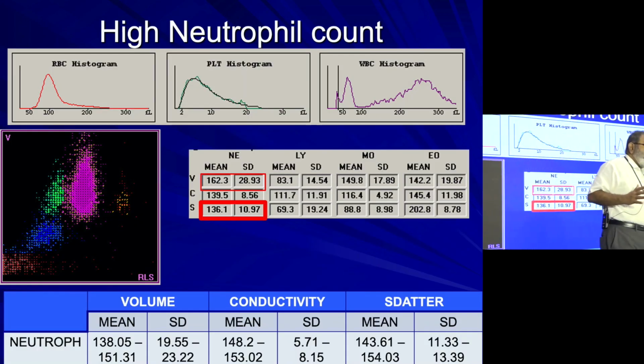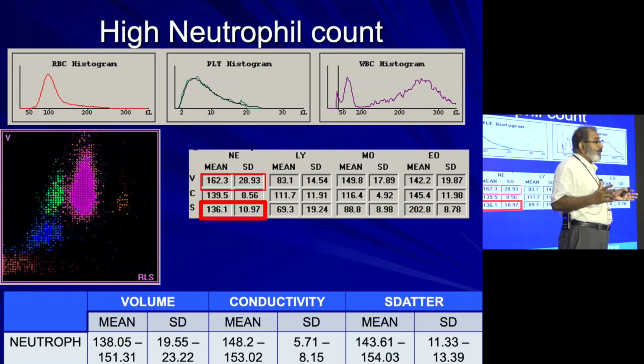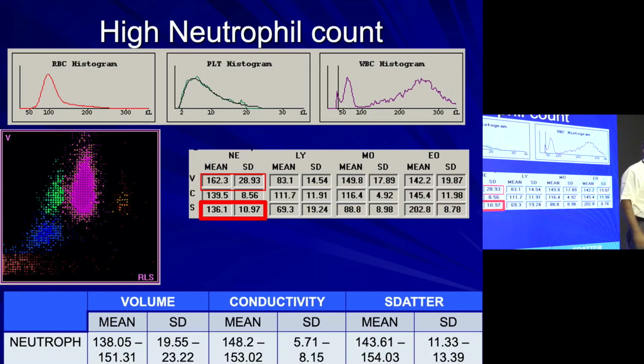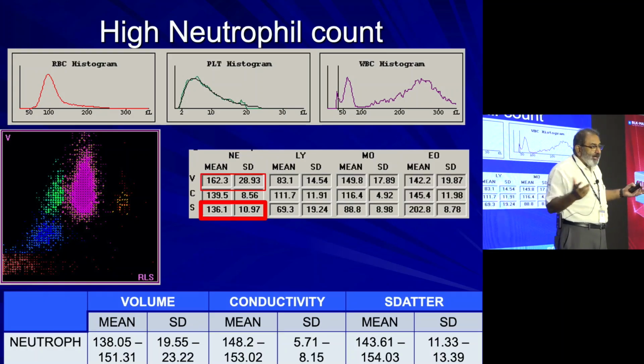It was a fantastic study. In fact, this is the first study we showed that cell counters can be better than any other parameter for sepsis. But the consistent finding was that the neutrophil was large in size. The intention of the study was that toxic granules mean more granularity, more scatter.